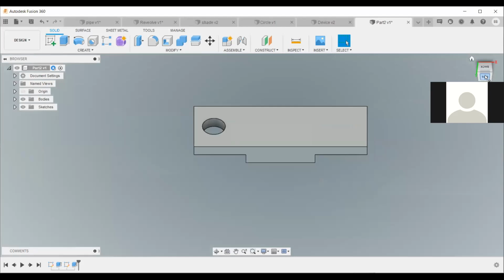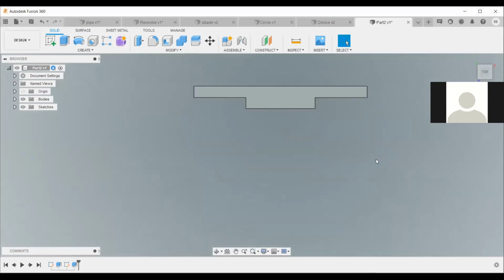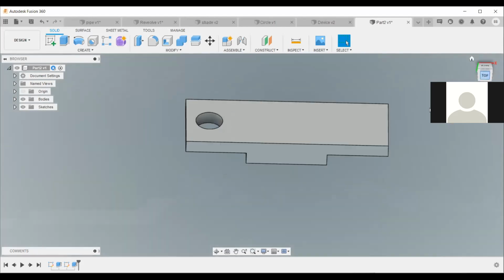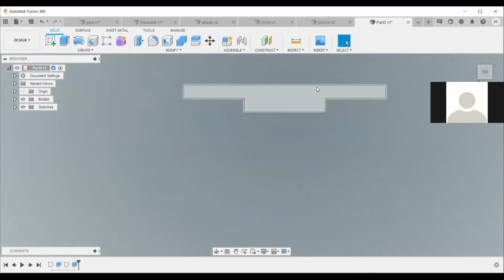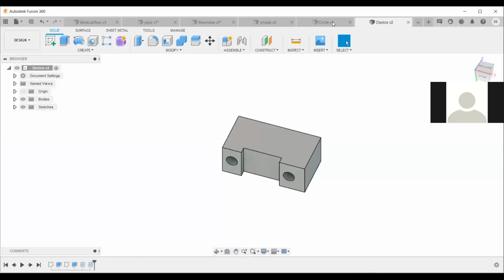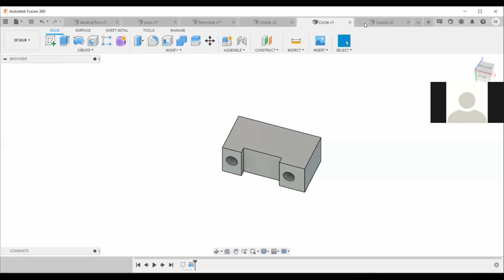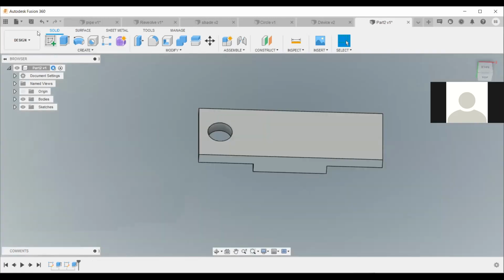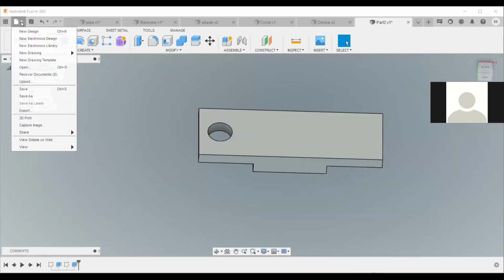Okay, I want to go back. I want to go to the everything. You'll finish it. You get the idea that you can create 2 holes from both sides. Okay, guys, are we together? Yes. Yeah. So this is part 2, and then this other one was part 1. So if somebody gives you an assembly, how do you do an assembly? You come now and create a new.